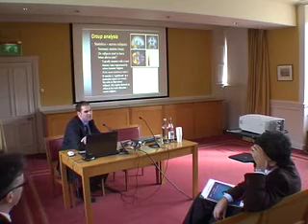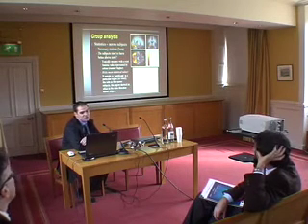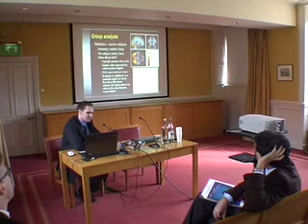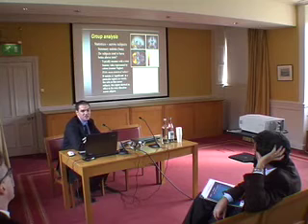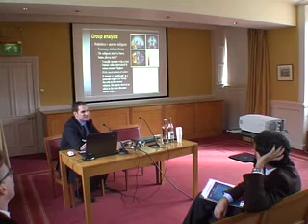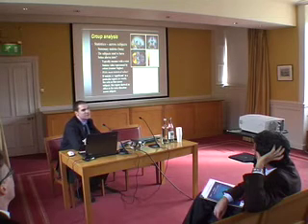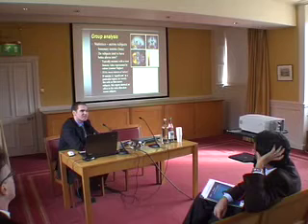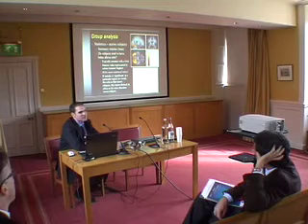So you can see the coloured bar there, which goes from about 0 to 20 in this case, because it happens to be a particular type of brain activity that is very consistent across subjects. You can see that the warmer the value, the closer it is to white, the higher the t-statistic. Those of you familiar with statistics probably know that a t-statistic of about 2 represents a p of about 0.05, or a 1 in 20 false positive rate.